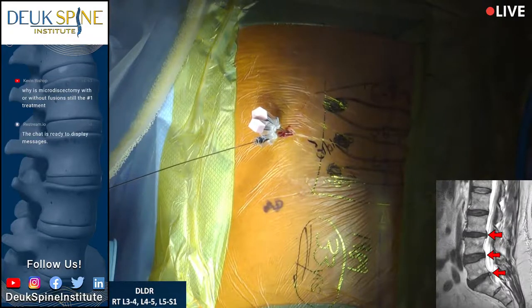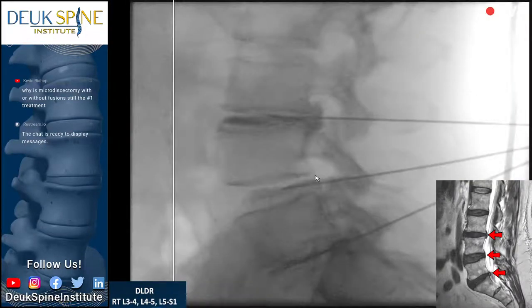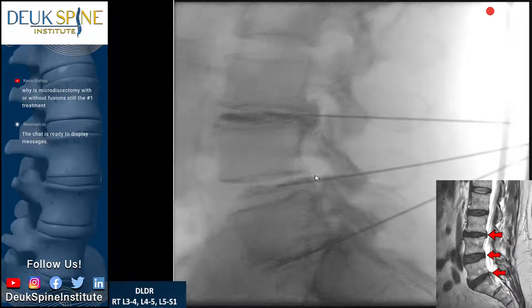Now, just while we're here on this x-ray, Flynn, go back to the x-ray, take a shot, and I want you to show them with the arrow where the herniation is. You can actually see the herniation with the discogram at L3-4. Look at the size of that herniation. There it is, that big black thing bulging out. That, Monica is outlining it. That is the herniation. And the nerve root that goes down his right leg is coming out of the hole just above it. Show them that area just above it.